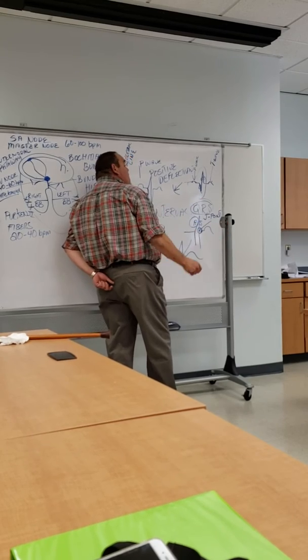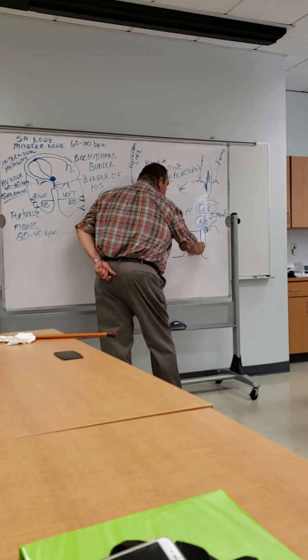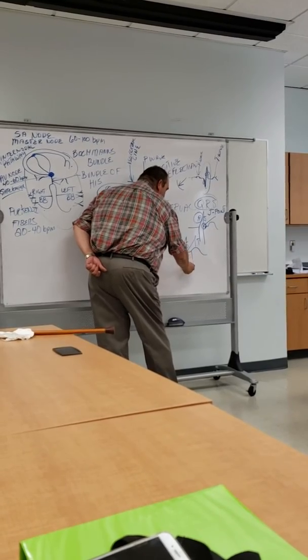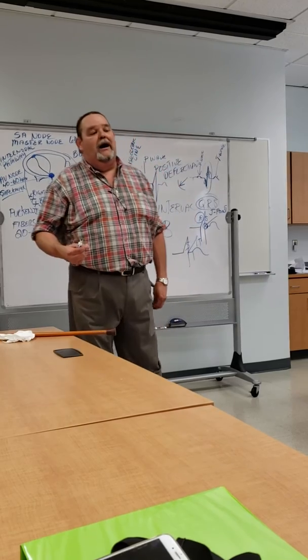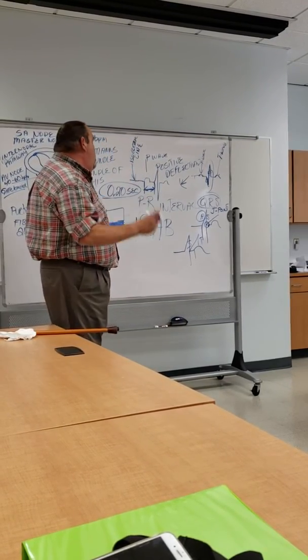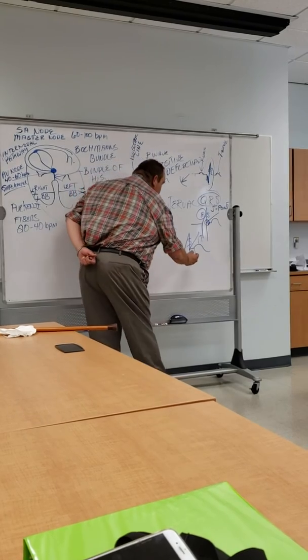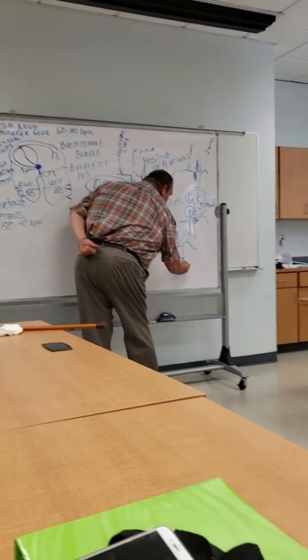It is the beginning of the ST segment, which is this portion right in here. That's where you're looking for elevation for an MI on a 12 lead. That's why the J point is so important, because you're going to be looking for elevation at that ST segment, which is between the S and the T wave. ST segment.